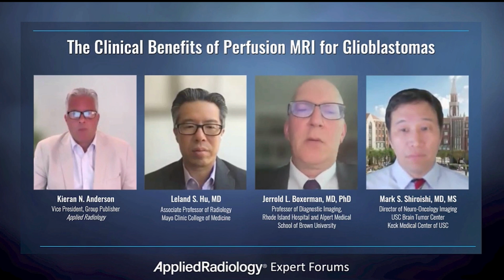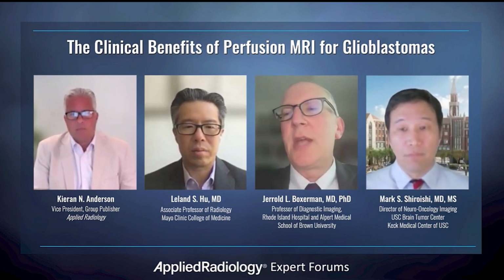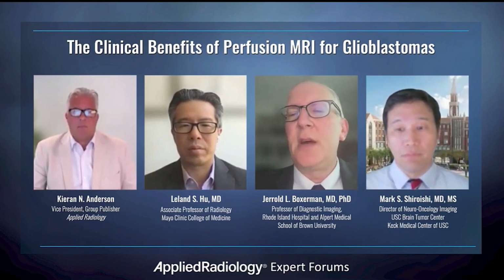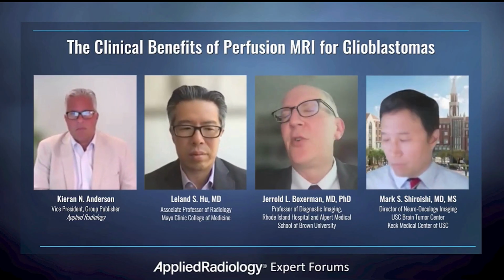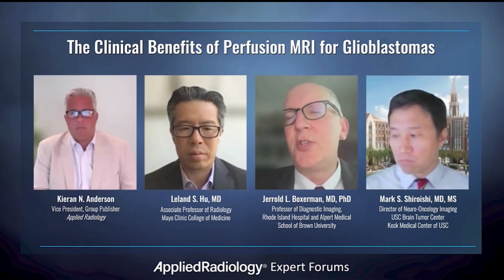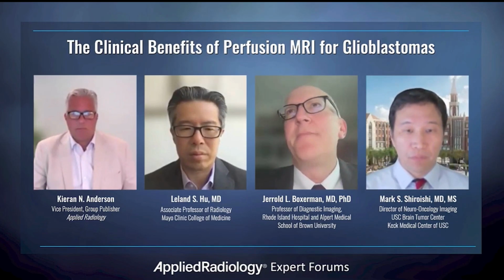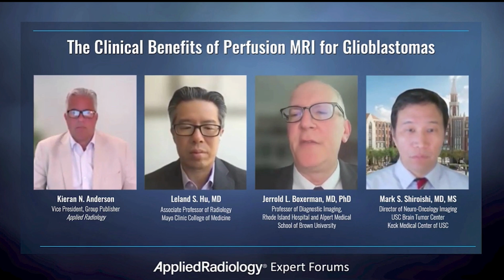Yeah, I think, echoing some of the comments that Mark made, it's particularly helpful given that we use this technique for response assessment of high-grade tumors. The results of the CBV processing are commonly shown in a tumor board setting. And I found from personal experience that it took a little bit of time to educate the neuro-oncologists, neurosurgeons, and radiation oncologists about the value of this technique. This came about by showing the maps and discussing the implications of the findings at tumor boards.